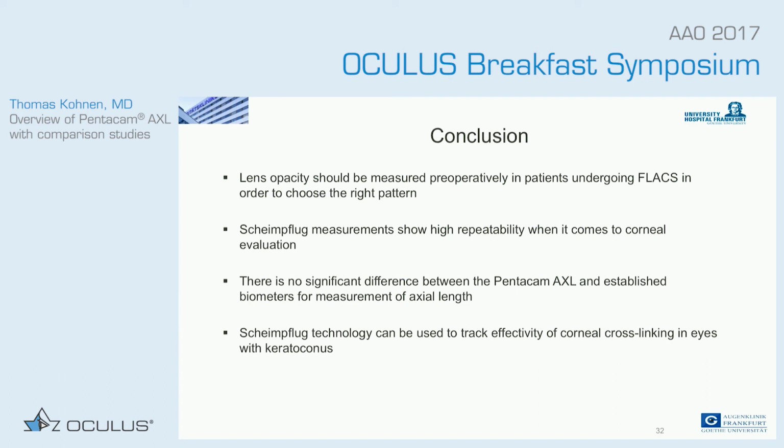So for me, the Oculus Pentacam is actually my device where I screen all my patients in cataract, refractive, and corneal surgery every day.